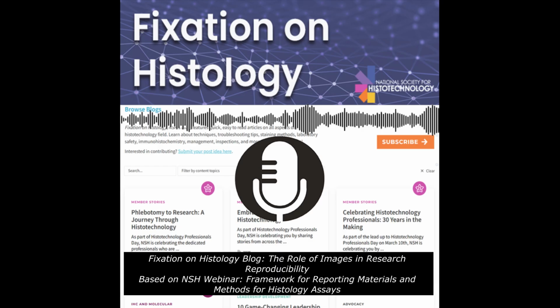In my digital image analysis methods, I included the scanner, the magnification, the acquisition software, and the version of that software, and the light source used, said Chlapala. I talked about how that instrument was calibrated, when and how I looked at it, and the image analysis software and the versions we were using. I even told what monitor we were using.